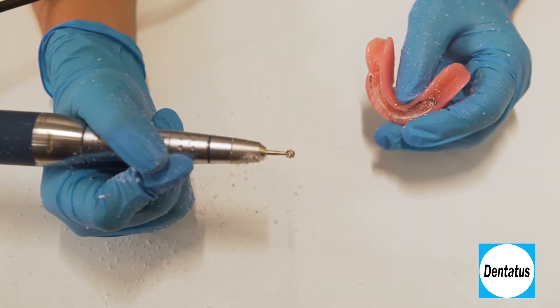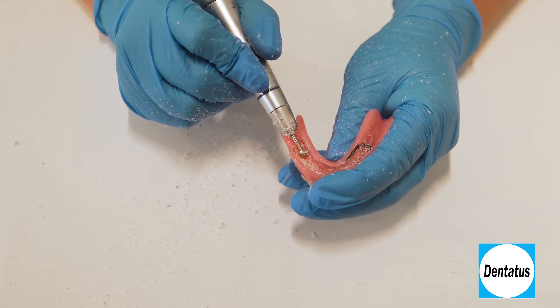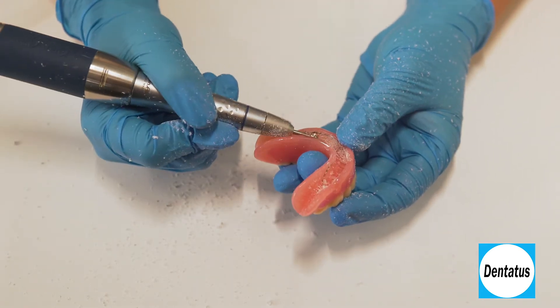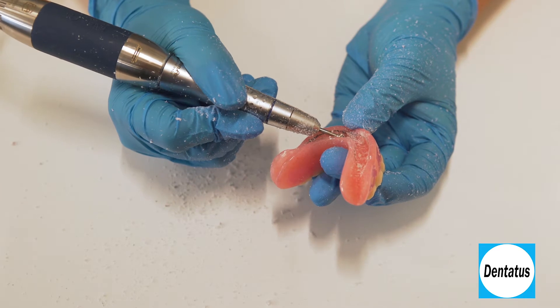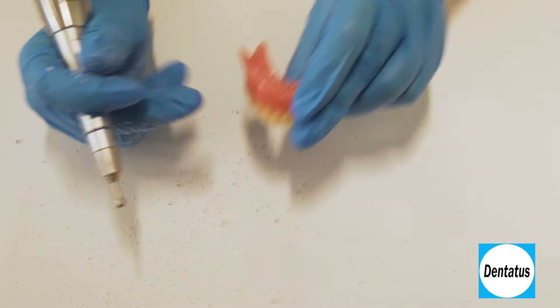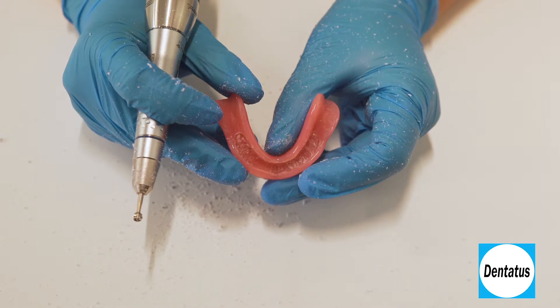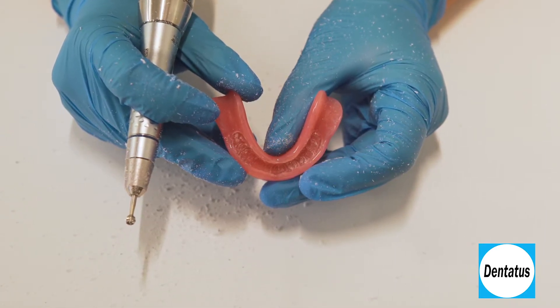The groove denture preparation instrument is used to create a one-millimeter depth groove that travels buccal-lingually on the intaglio surface. These are not for retention, but act as a depth guide and ensure an even, uniform surface. Remember, we want the base to be as smooth as possible to make it easier for the TuffLink silicone to flow. Take caution not to remove the undercut just created. If you do obliterate part of it, just go back and redefine that area with the half-round burr.